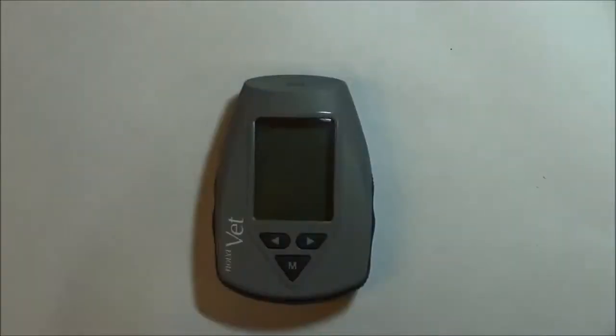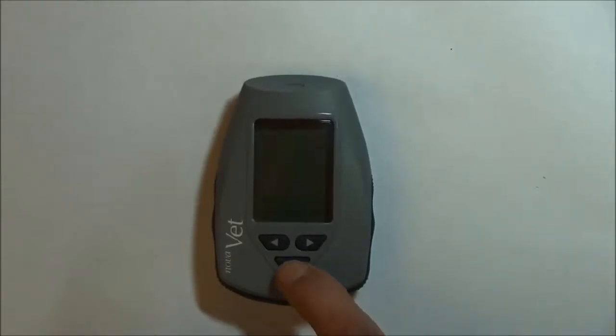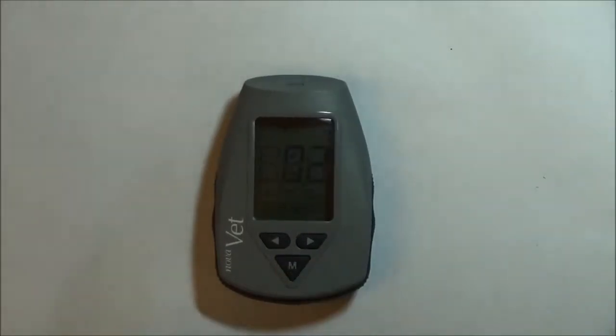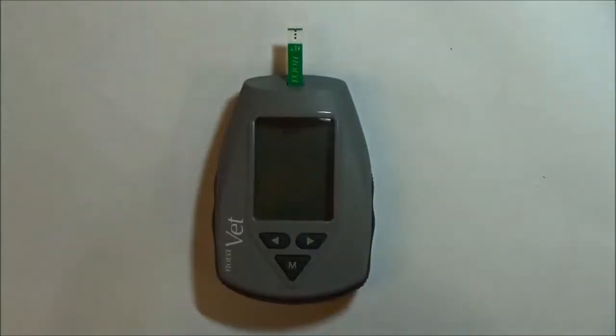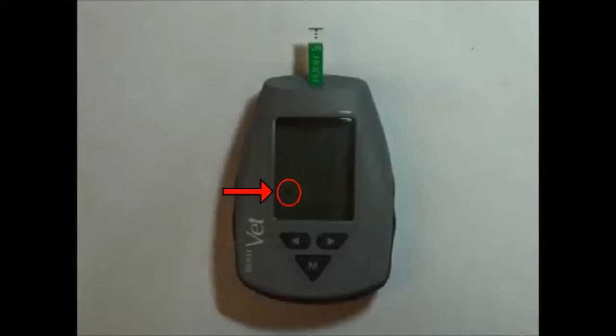To power on the device, press the M button. Next, insert the ketone test strip and wait for the blinking drop to appear on the bottom left-hand side of the digital display. This indicates the meter is ready for the blood sample to be applied to the end of the test strip.